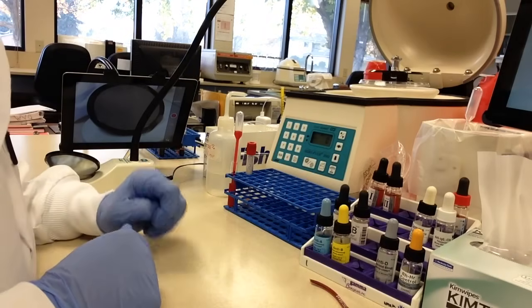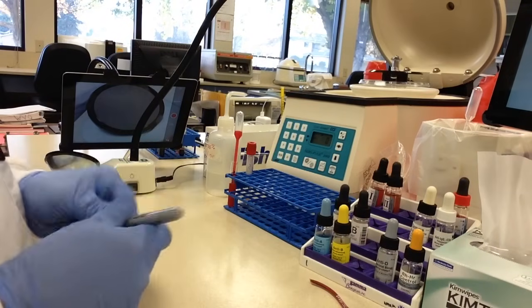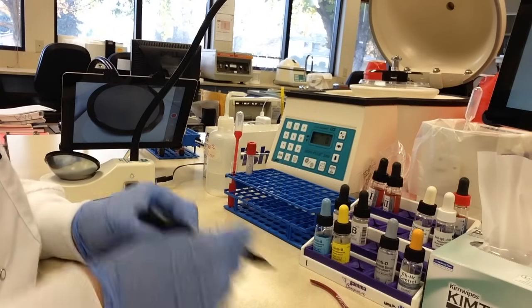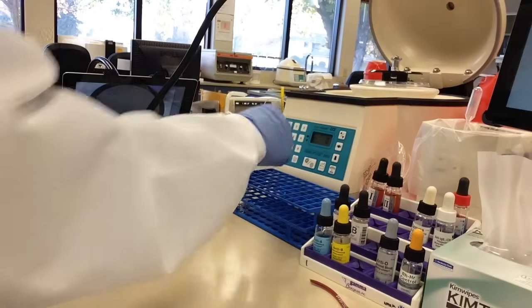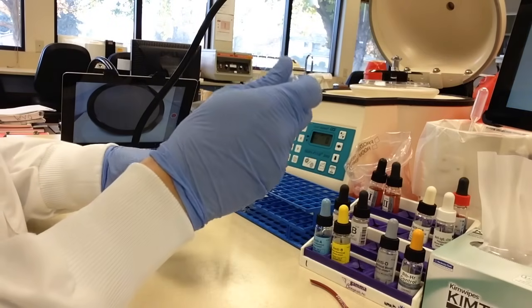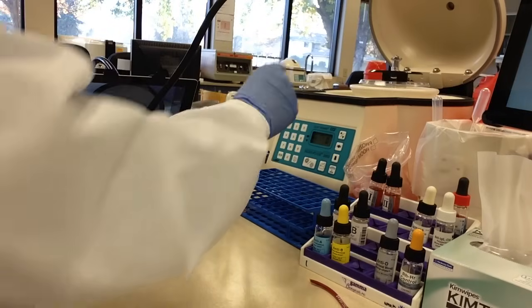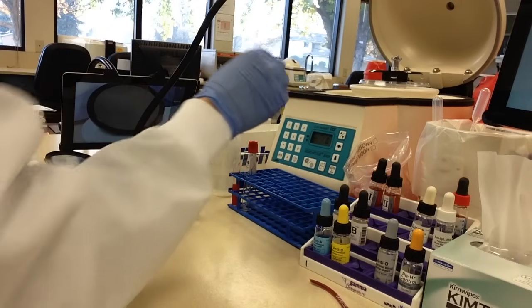We only need one tube for this procedure — one tube per unit. So I'm going to write the ID on it, 781, and put it right there. What we will do is add two drops of patient plasma and one drop of unit red cells.